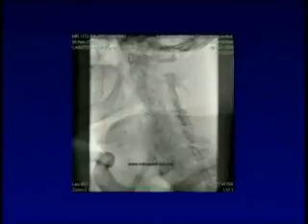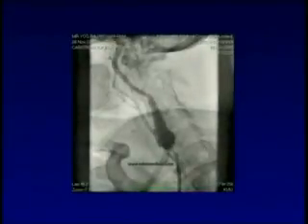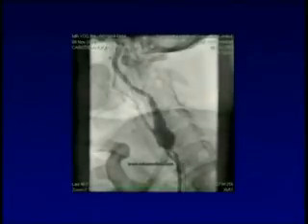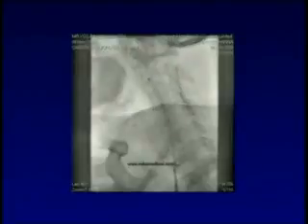Till that time there was no TIA or stroke. And once we had the filter in place, we put a Bard Fluency stent graft across this pseudoaneurysm. This is the stent graft being positioned there. And then we opened the stent graft and deployed it.